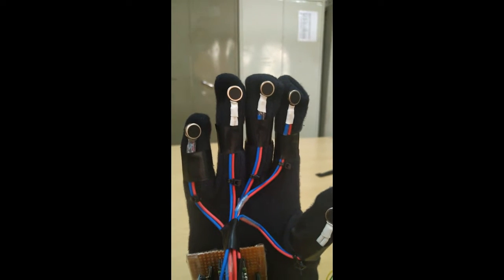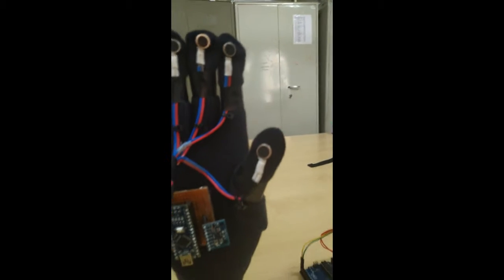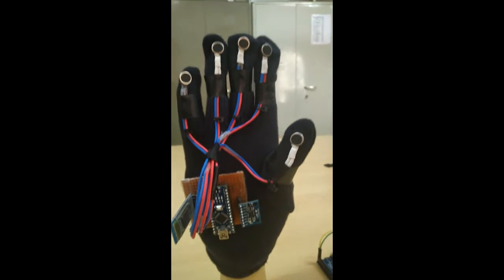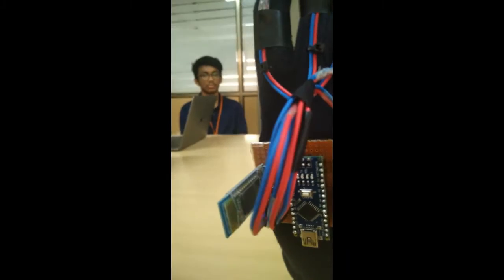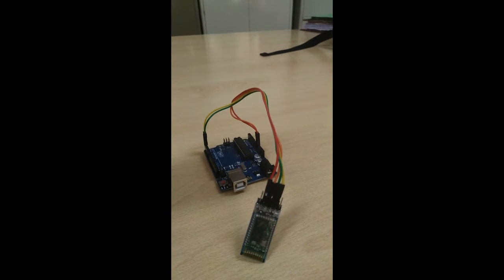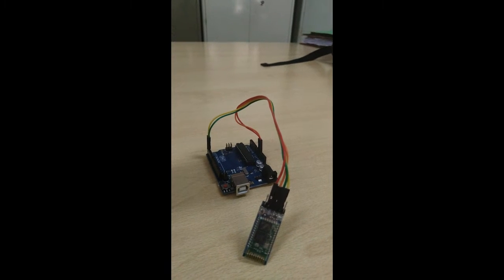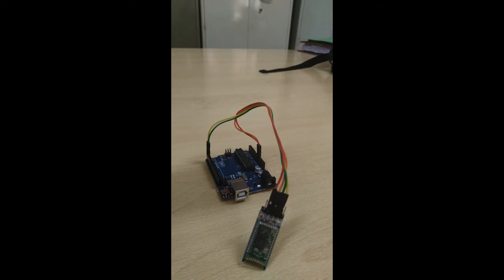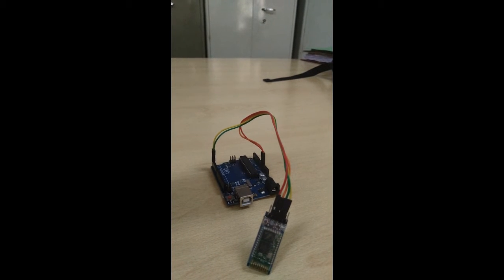So now, this data, whatever we are getting for hand tremor, should be sent to the server for us to do processing. So how do we do it? Very simple. We have used the Bluetooth module here, and that Bluetooth data will be sent on to this Arduino board here, through which we are sharing it to the server. In the server, we can clearly visualize all the data acquired from this coin motor side, from the glove side. With this data, we can understand and even predict what the tremor level is going to be next using our deep learning algorithms.